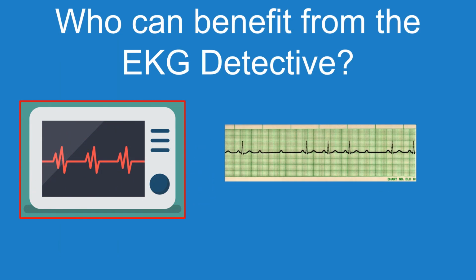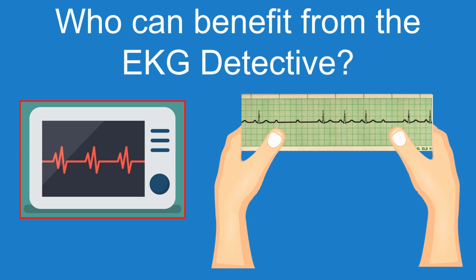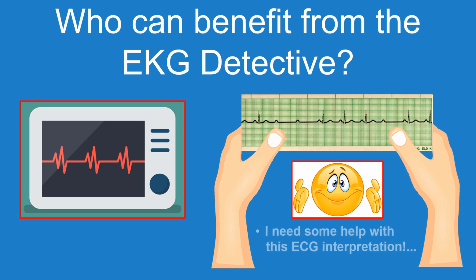So the biggest question to ask is, who can benefit from using EKG Detective? And the answer to that is anybody who is struggling with an ECG interpretation. The nice thing about this process is it allows you to focus on the waveforms and the things that you can see in the ECG, and you don't have to spend as much time focusing on the criteria within an ECG.